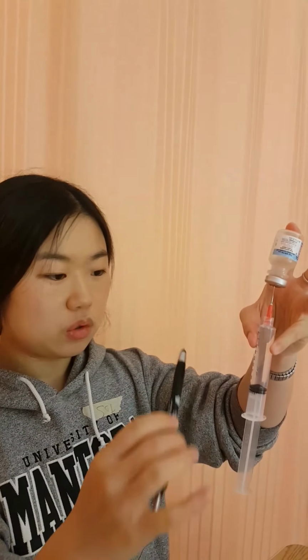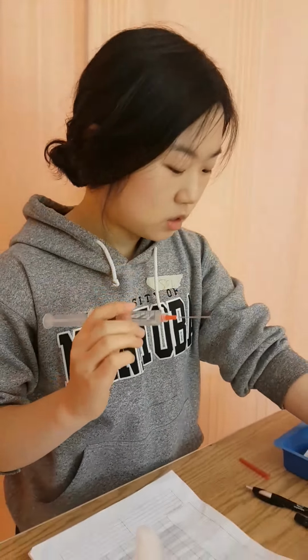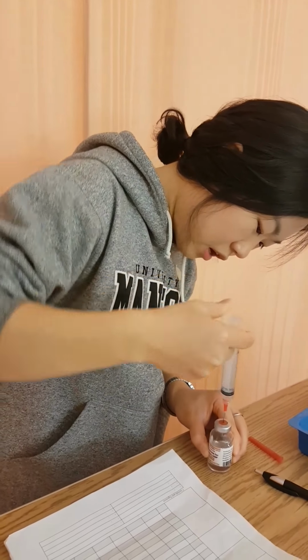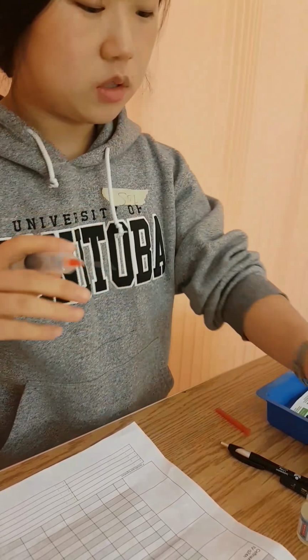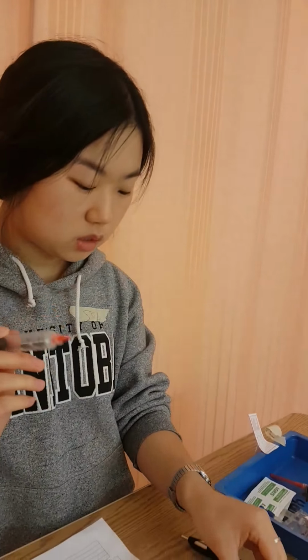I'm going to make sure all the air bubbles are gone, and there aren't any. Taking this out and putting it into my first vial. I'm going to allow the air to escape to relieve pressure. So this one's done. Then I'm going to do the same thing for my second vial here, 9.6 milliliters.